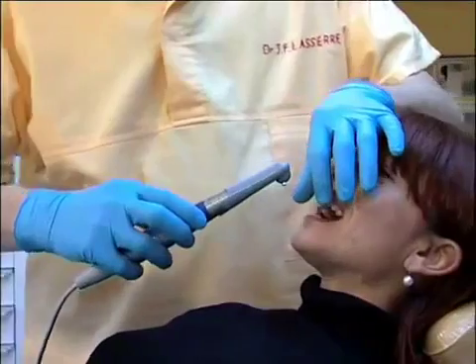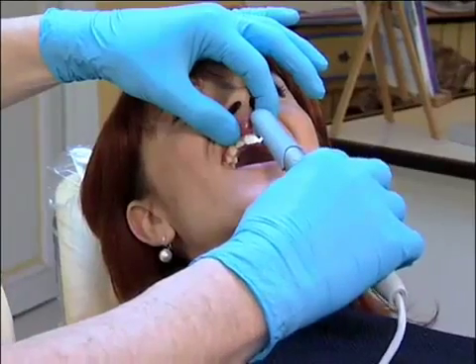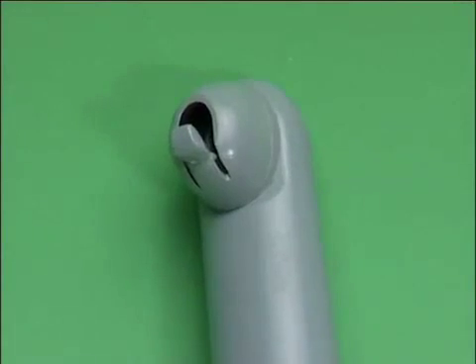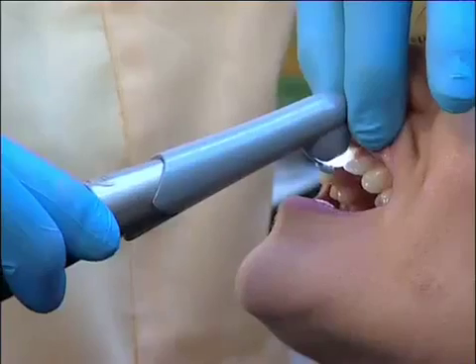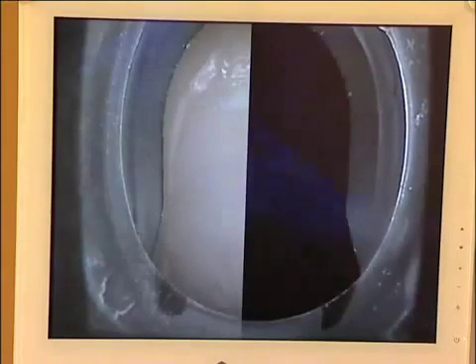The first step consists in putting that tip parallel to the tooth surface, making sure that the tooth's incisive edge fits in the special stabilization notch. When the positioning is correct and controlled on the screen, the finger will press the Sopro touch to freeze the left half side of the reference image of the tooth.